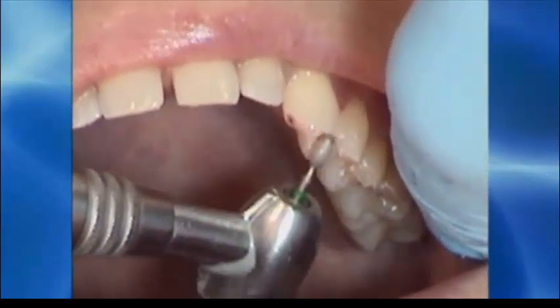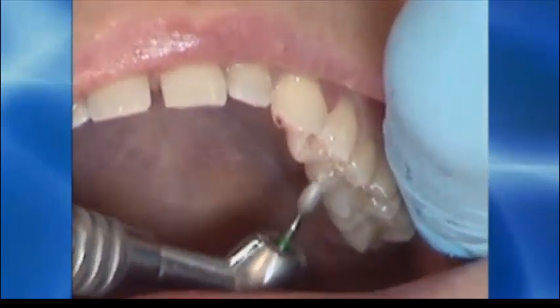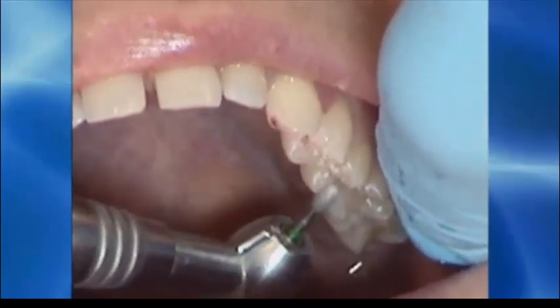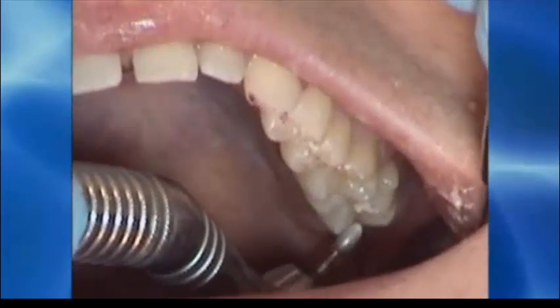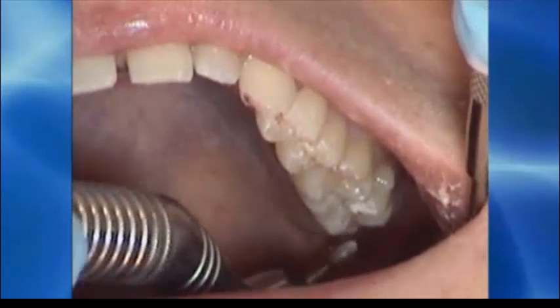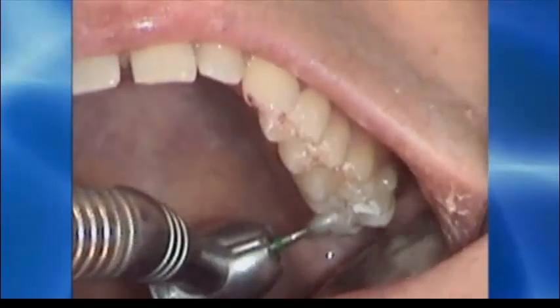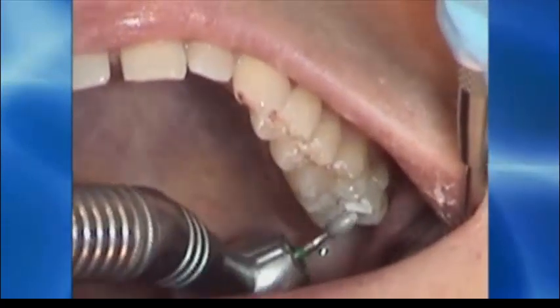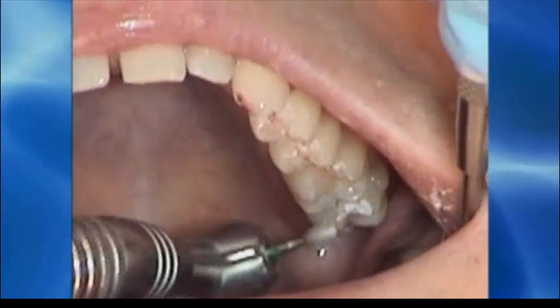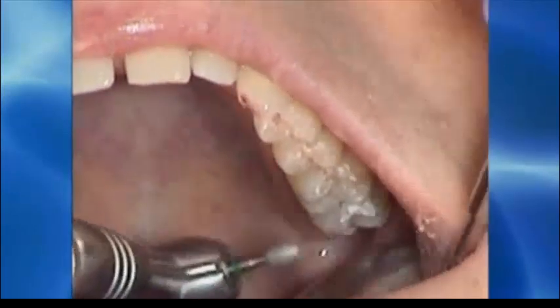And here I'm reducing the size of the lines around the central fossa and the mesial marginal ridge on the first premolar and second premolar. Now I'll move to the balancing incline on the inner aspect of the upper left second molar, try to shallow that incline so that the lower tooth misses it as it passes by when the patient moves to the right. And this is a key area in this patient's treatment. And here I'm just refining these initial markings.